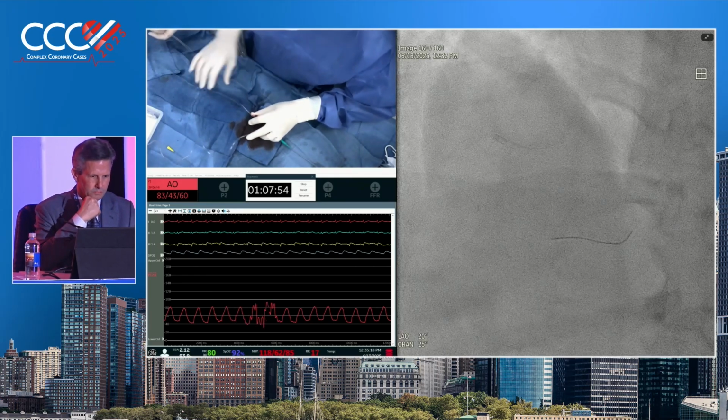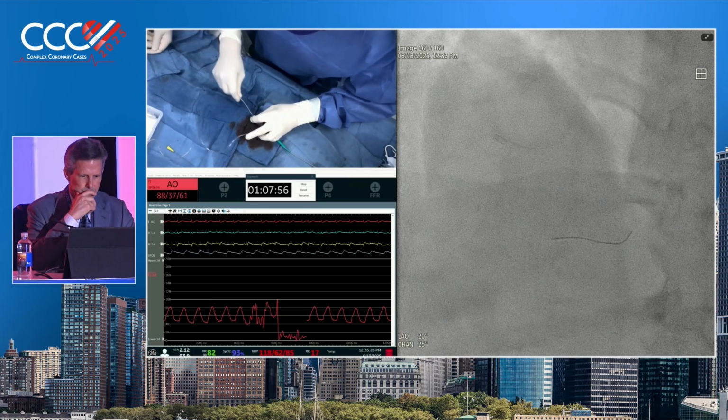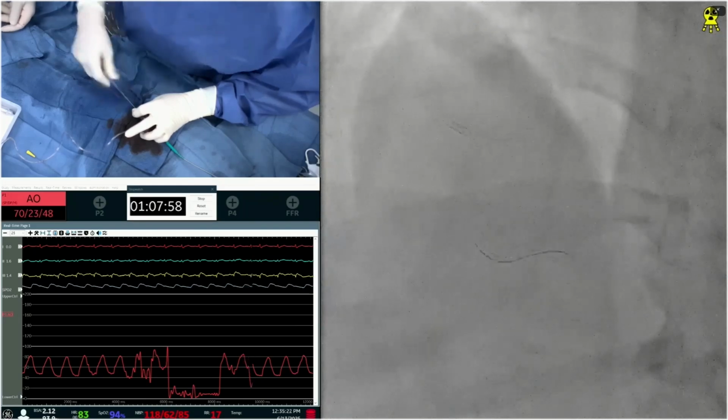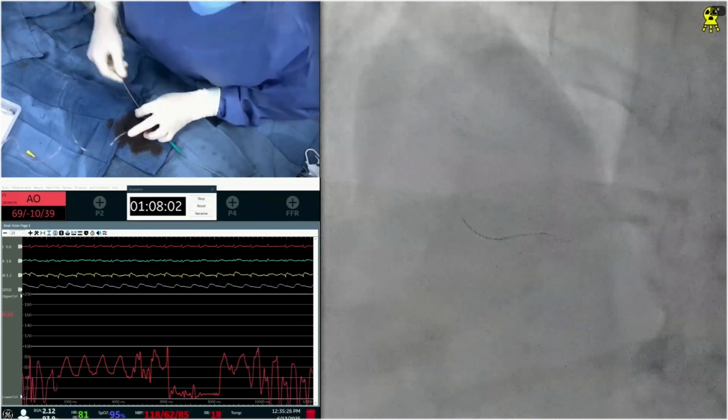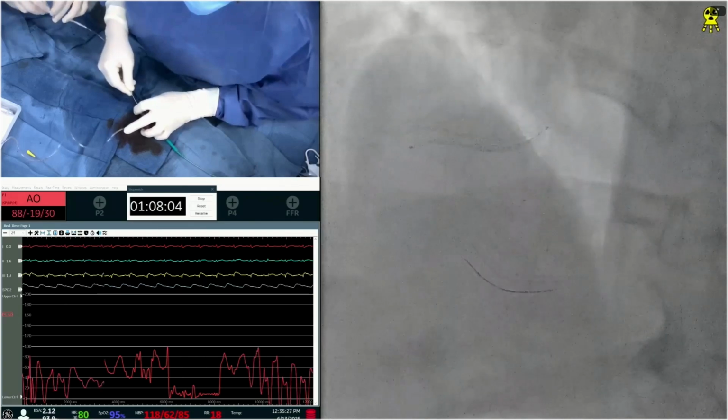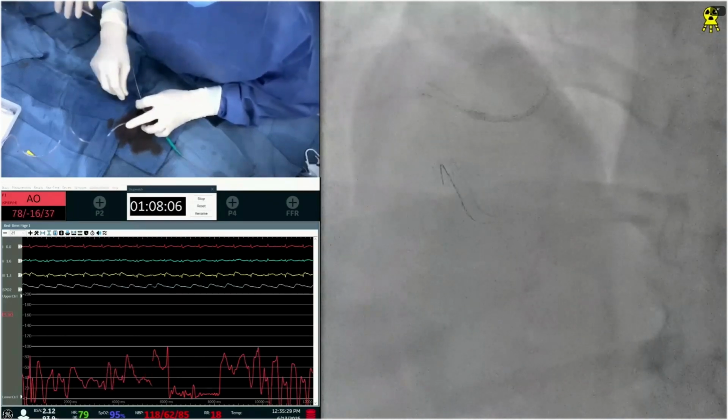But I mean, nationwide, atherectomy's been decreasing anyway with the advent of IVL. Yeah, but increasing in terms of the combination. More on the combination rotational therapy.